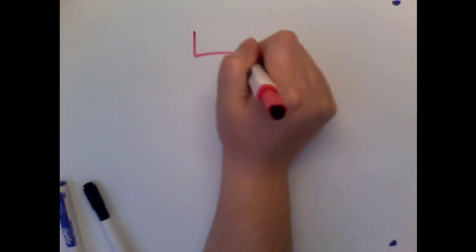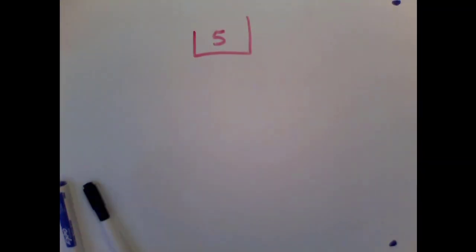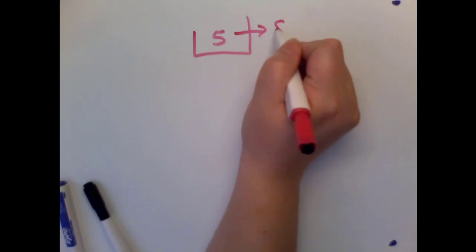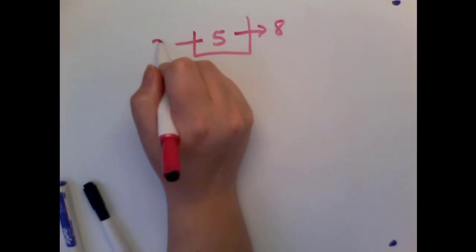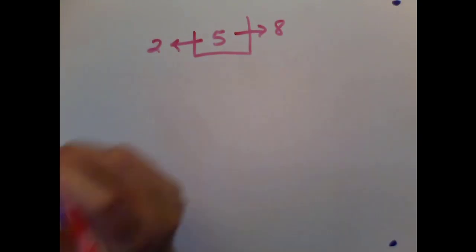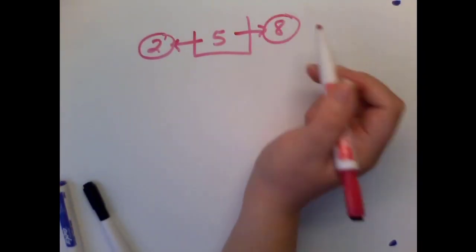So let's head back to the whiteboard to take a look at these examples again. So we have our transducer. It's a 5 megahertz transducer. That is its resonant frequency or its main frequency, but it can emit up to an 8 megahertz and down to a 2 megahertz. So remember, to figure out bandwidth, we are subtracting minimum from maximum.